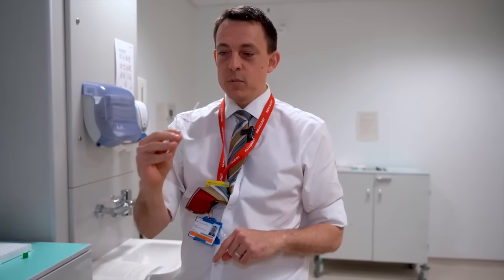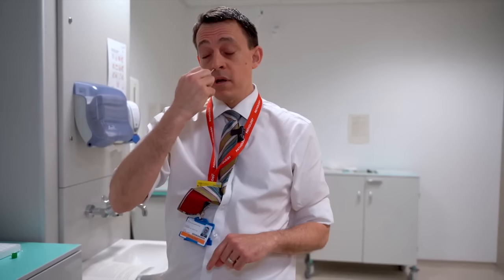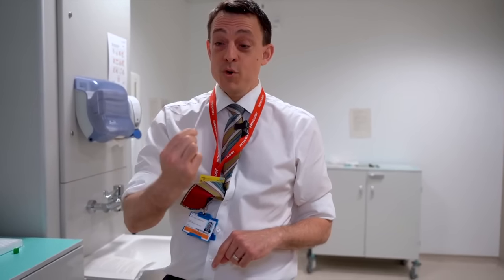Next it's time to swab your nose. The swab goes into the bottom of the nose and is pushed back as far as it can go until you hit resistance, then turned around and removed.